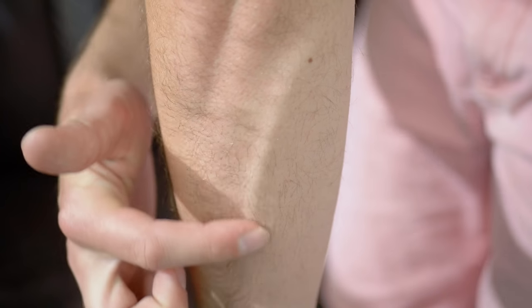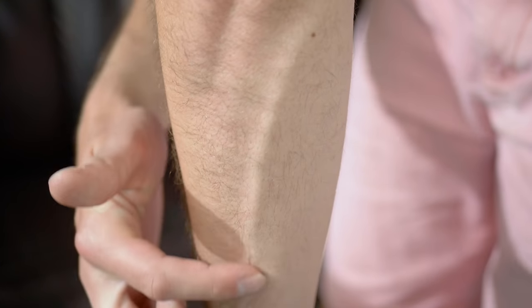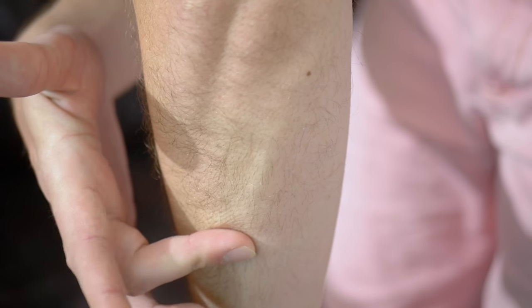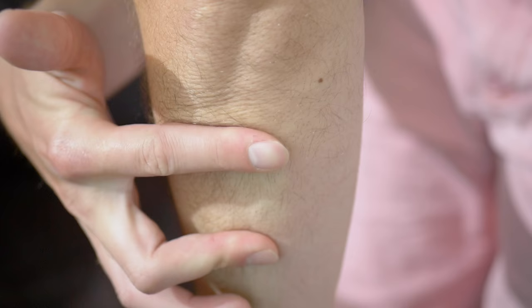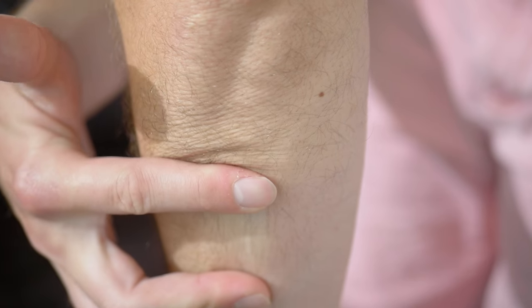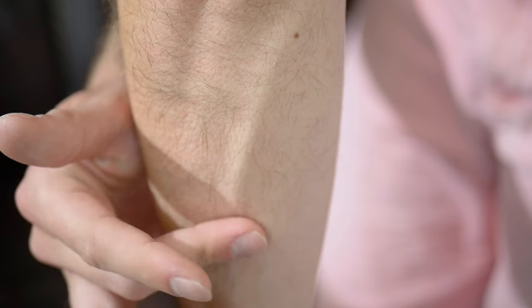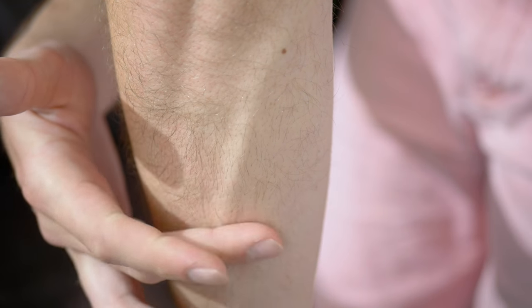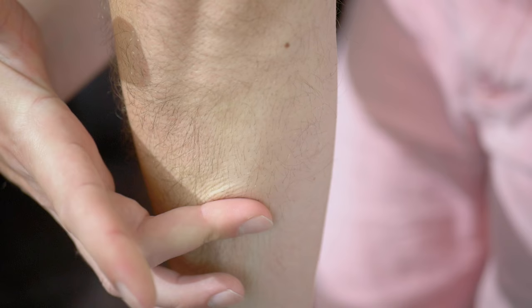Another type of vein you might come across is on the back of the forearm, particularly in men. Unfortunately, this vein is often quite deceptive — it looks massive, like you could easily get an 18 or even bigger in there. But as I'm demonstrating here with a valve test, there are tons of valves in this vein. This is not unique just to my arm — in general, these veins almost always have a lot of valves in them.